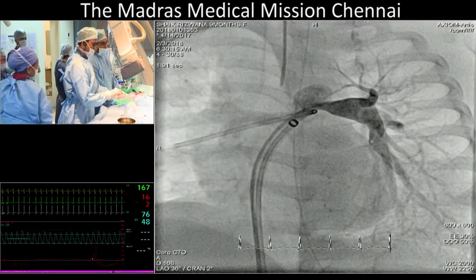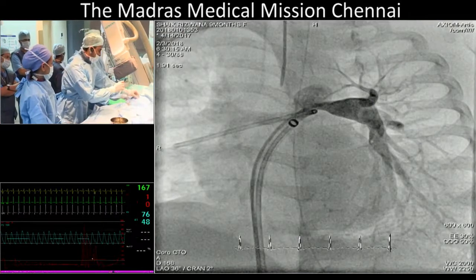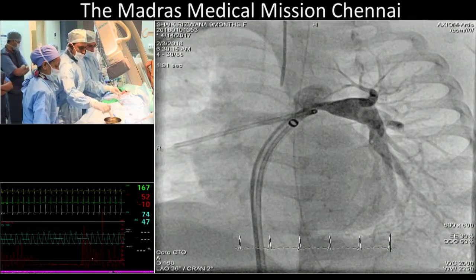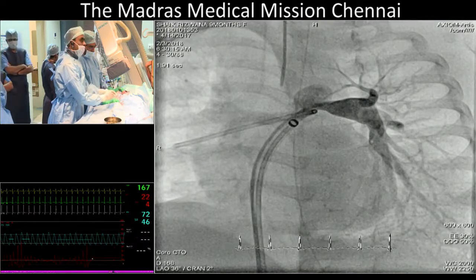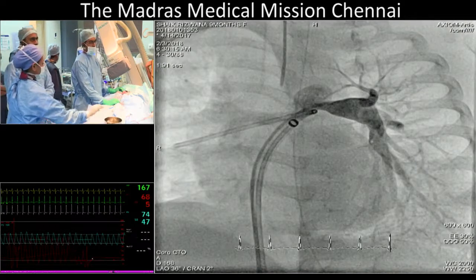So my question is really why I would reduce my intervention on dilatation and avoid stenting at this time, because the patient has a right ventricular pressure of half. A follow-on question, don't go away yet. Balloon dilation alone, low pressure, high pressure, cutting balloon, which?